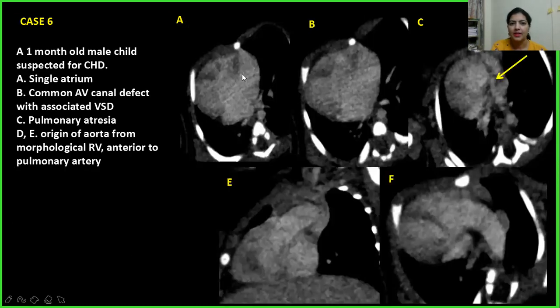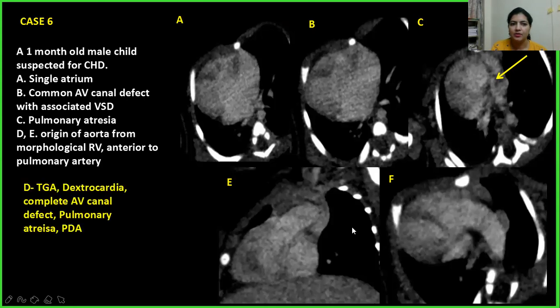Case 6: A one-month-old female with a common single atrium, common atrioventricular defect with associated VSD, pulmonary atresia, and origin of the aorta from the morphological right ventricle anterior to the pulmonary artery. This was a case of DTGA with dextrocardia and complete AV canal defect.